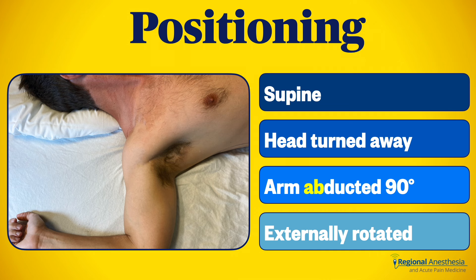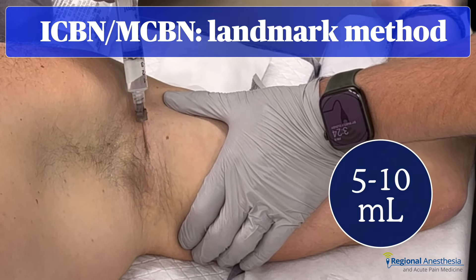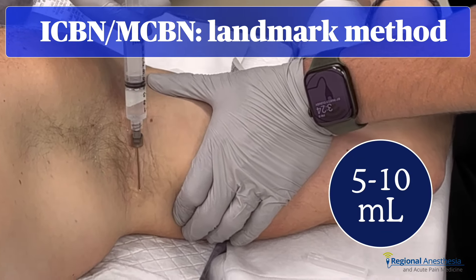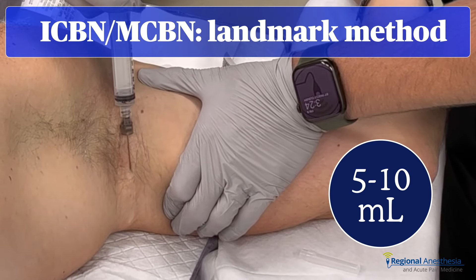We can block these two nerves together safely and easily in one go. There are two techniques, both using the same positioning with the arm abducted to 90 degrees. A common method is to infiltrate the subcutaneous region of the axilla with 5 to 10 mils of local, starting just superficial to the axillary artery and infiltrating down to about where the arm meets the bed.